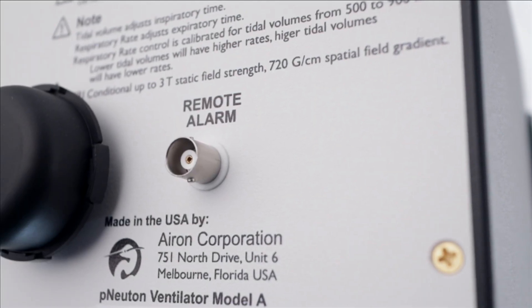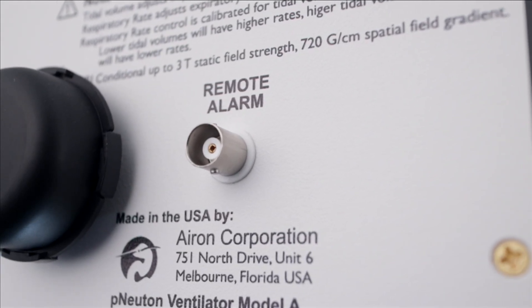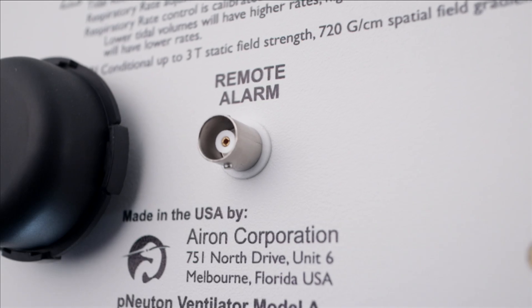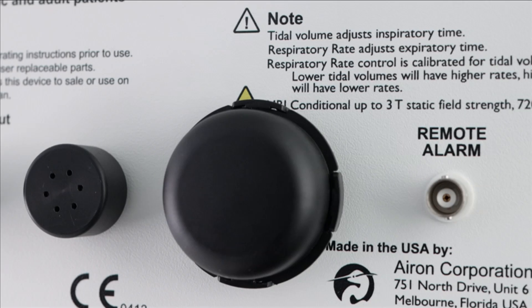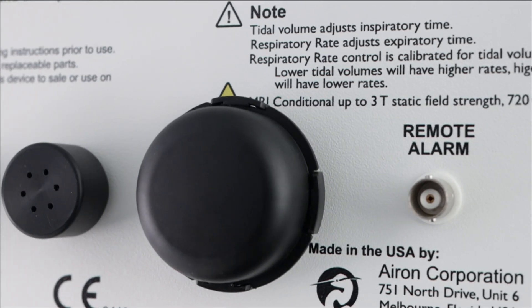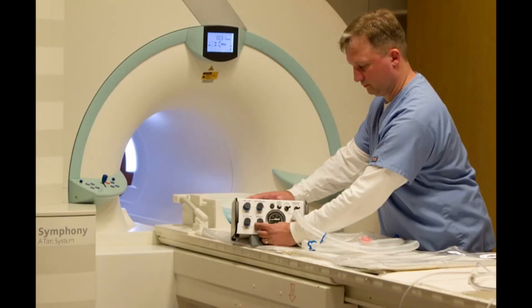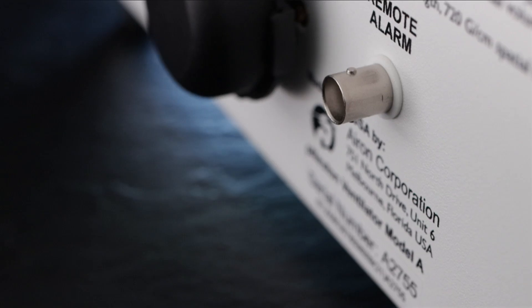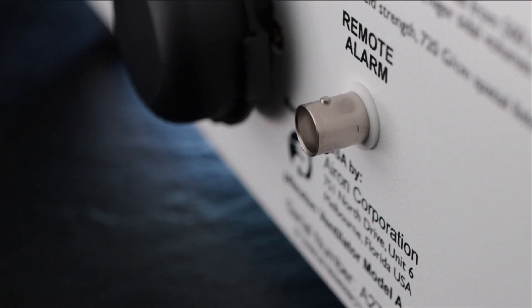Remote alarm output. The next feature to note is the BNC fitting for an optional remote control alarm. This remote alarm fitting will only work with Aeron supplied remote alarm cables. The remote alarm is ideal for use with an MRI transport because it allows the Model A to be next to the MRI and an alarm box to be placed in or near the control room, making the alarm audible even while the MRI is running. This provides added safety for your patient and peace of mind for you, the healthcare provider.